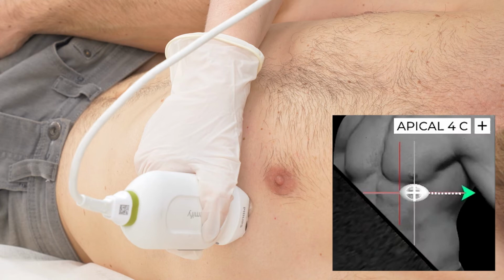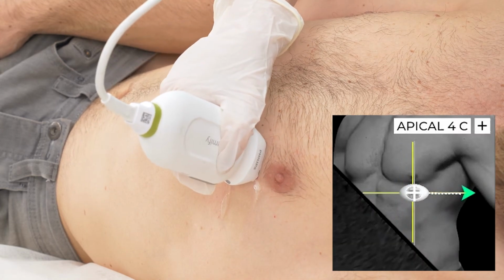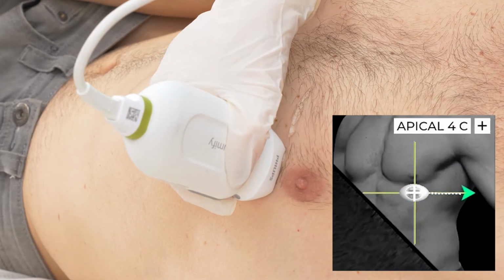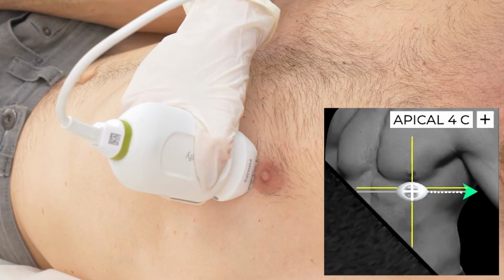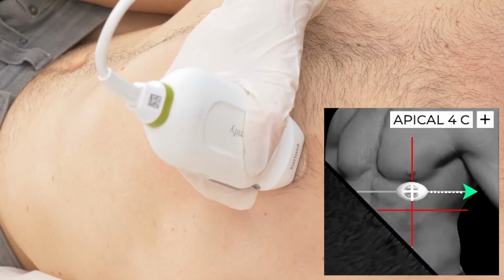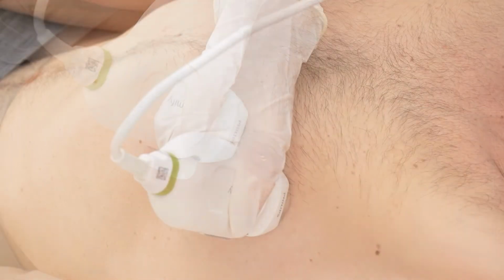In the current example, the user is instructed to slide the probe to the left in the direction of the target axes. And now the user is instructed to slide right. In this example, the user is guided to slide up towards the target axes. In this example, the system instructs the user to slide the probe down.